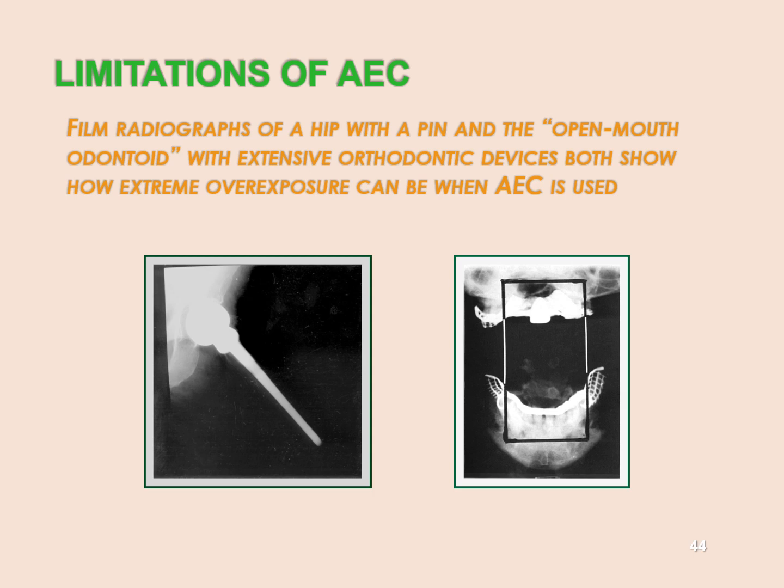Didn't account for the mandible with dentures and the maxilla with dentures also being in the chamber, and so we ended up running the exposure long. Now both of these are on film, so it does affect the overall density. It won't look as bad on digital, but it'll look bad.